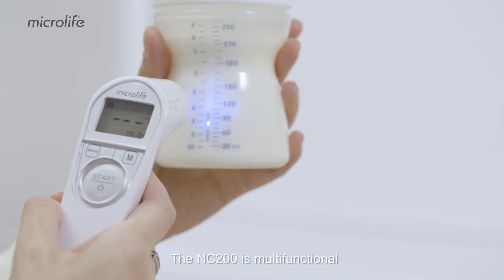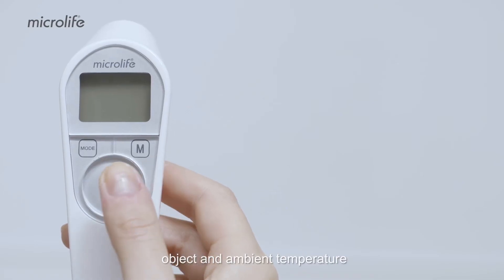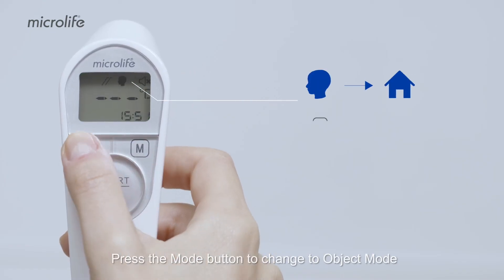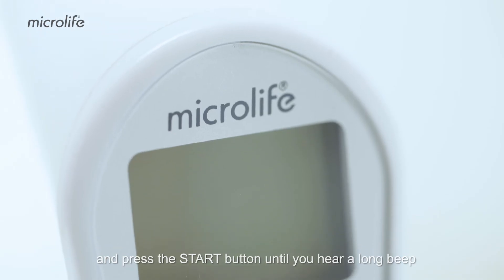The NC200 is multifunctional and can be used to measure body, object, and ambient temperature. Press the mode button to change to object mode. Aim at the center of the object and press the start button until you hear a long beep.